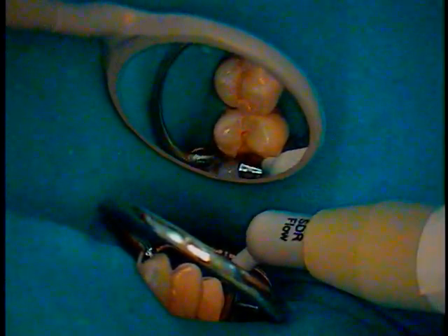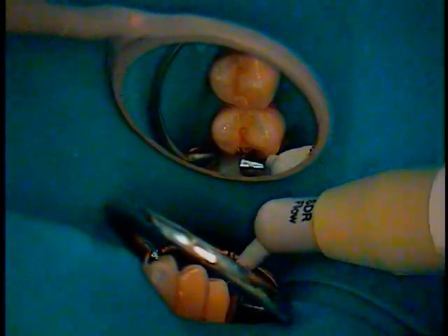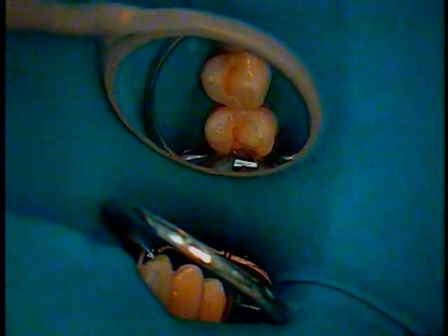All we need to do now is place something called flowable, because I like a wetting agent in there before I start condensing the composite incrementally to prevent the C factor, or that cavity configuration factor that has been studied since 1987 from what I understand, and it's been revisited several times, probably still revisited. Now that's my flowable.